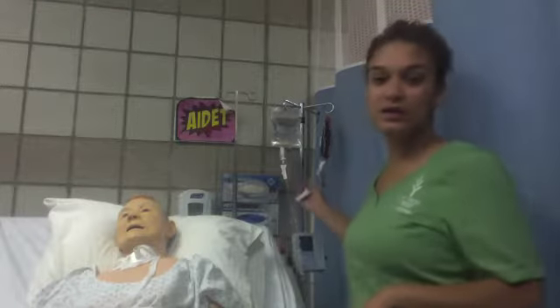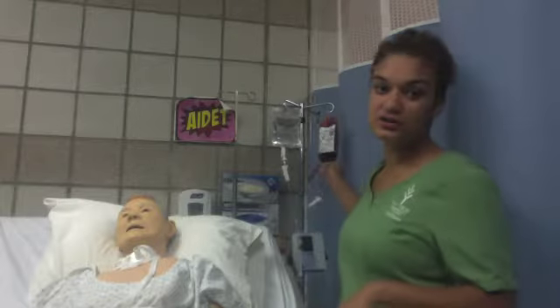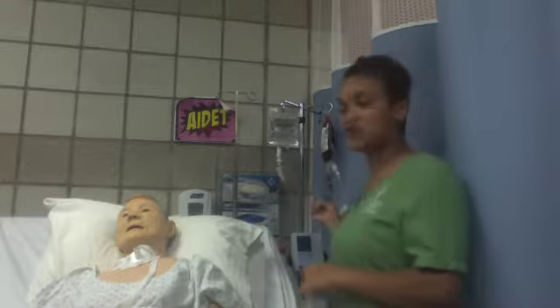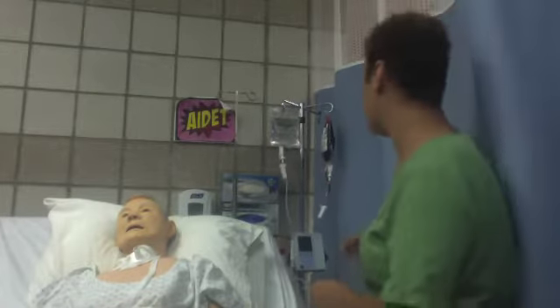So now that my bag has been hung, and it is looking good, I've checked the expiration, it's not leaking anywhere, the tubing's not leaking, the tubing is within its expiration date as well, because I just hung it. Like I said, the saline was running, I would have stopped that and clamped everything up just prior to spiking my blood bag.